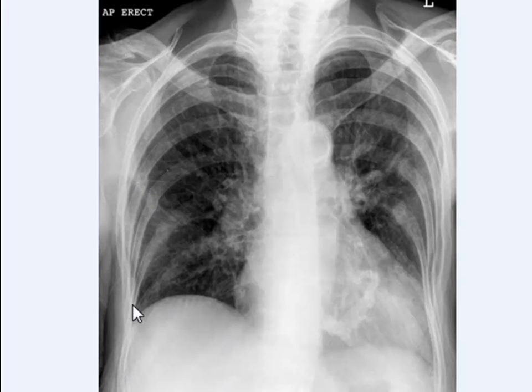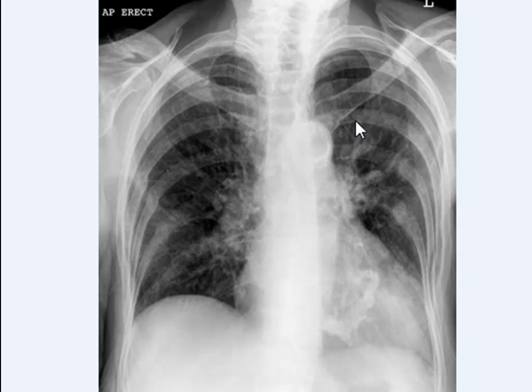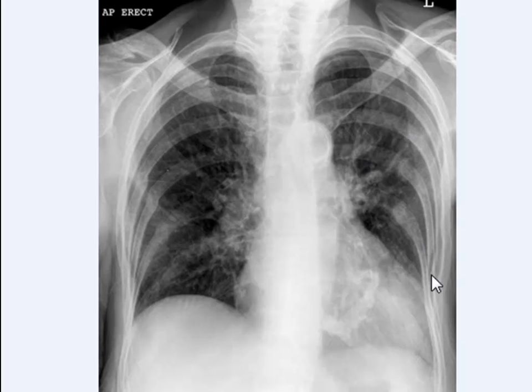If you pay attention to the anterior ribs, they're all pointing downwards towards the patient's feet — all of them. So they cannot be traced in this direction. These are posterior ribs and they are all moving down.